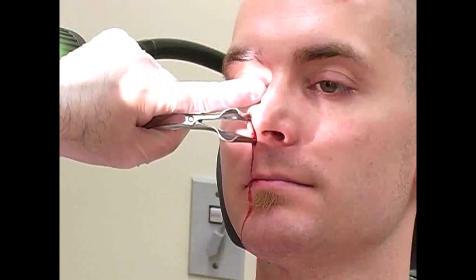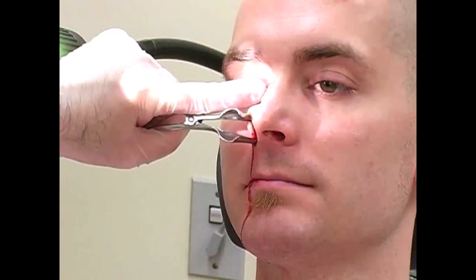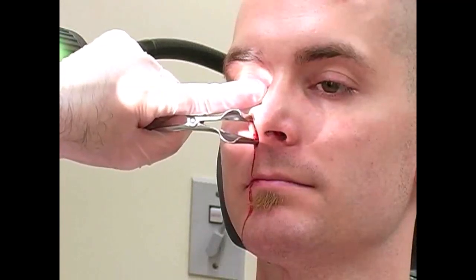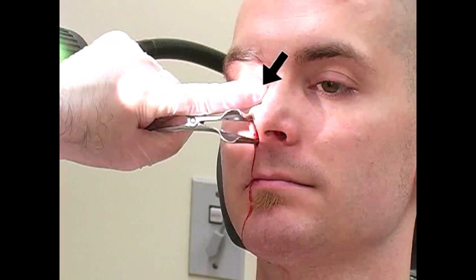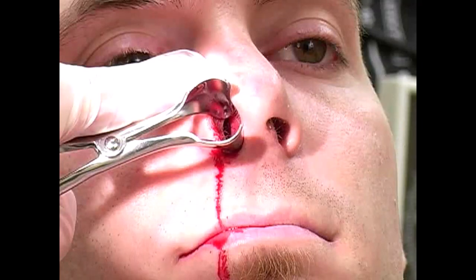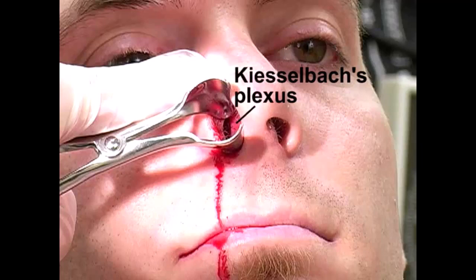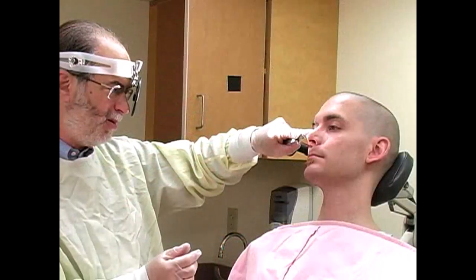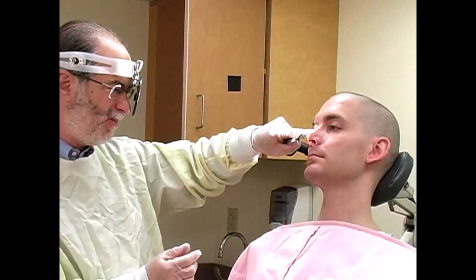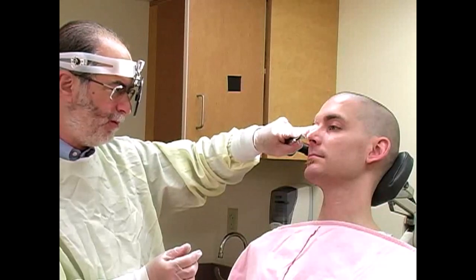Insert the speculum so that the device may be opened vertically. You may place your index finger on the nose to stabilize the device during visualization. Look for evidence of active or recent bleeding on the anterior portion of the nasal septum in the region of Kiesselbach's plexus. Also assess for blood flowing anteriorly from the back of the nose.